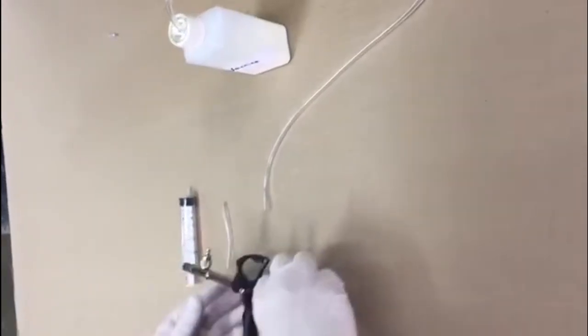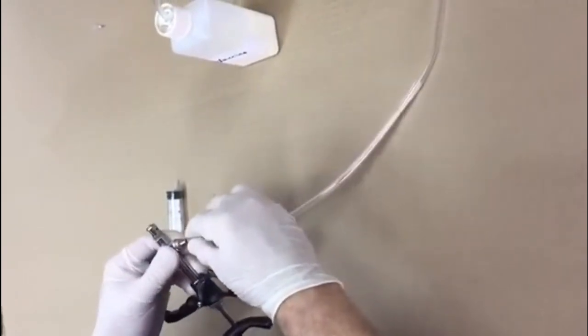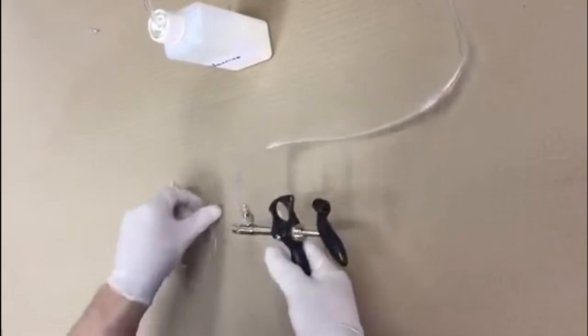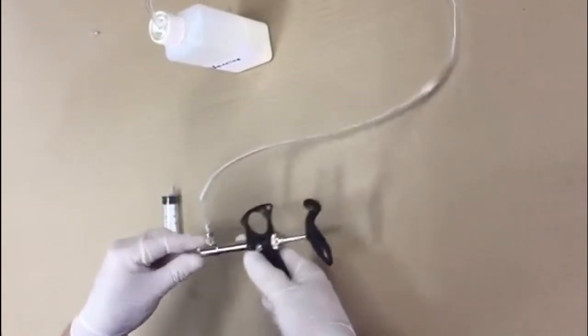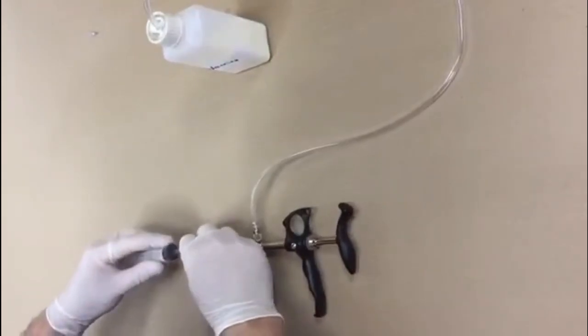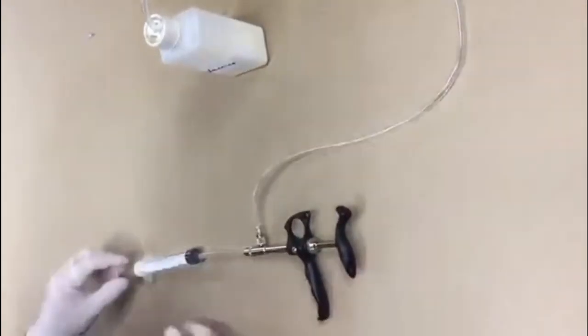Connect the tube to the syringe. Connect a small piece of tubing to the front of the Thauma syringe. Connect a large disposable syringe to the other end of the small tube.